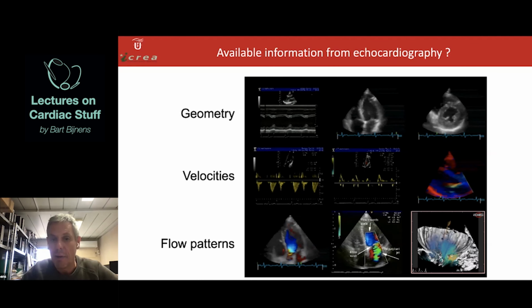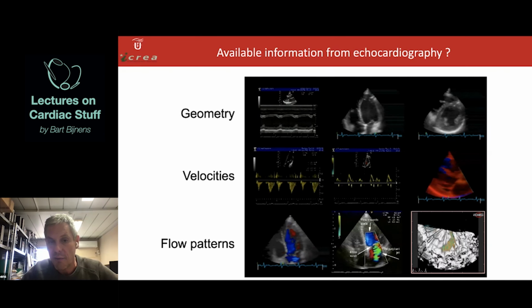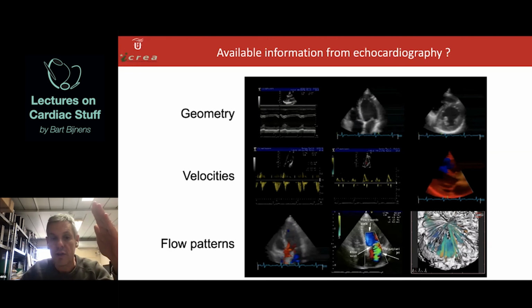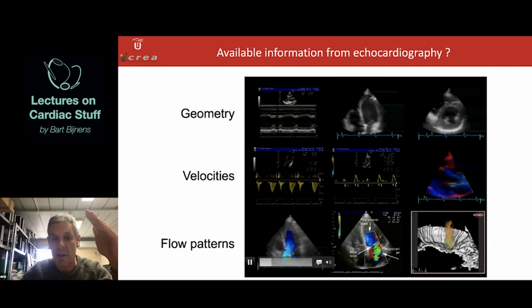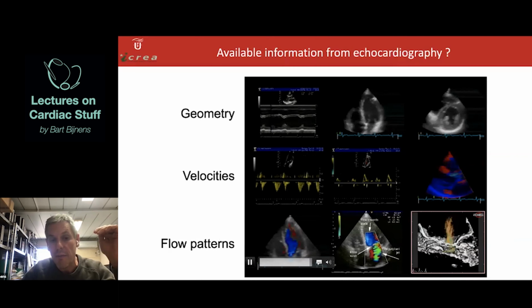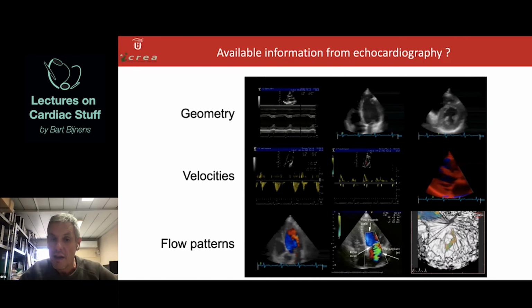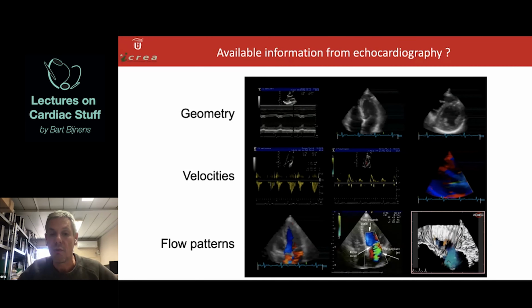Like here, for example, you have the left atrium and the left ventricle. Normally, you have color flow where red flow is towards the transducer. Towards the transducer in a sector image is towards the point of the triangle. And blue is away from the transducer. And of course, when we have turbulence, where we have velocity vectors in all directions, in this case it's shown as green, as the combination of blue and red.